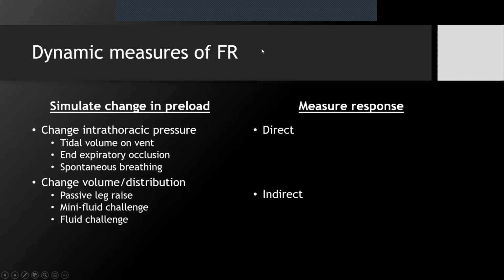So direct ways to measure cardiac output would be a PA line, but it's pretty time-consuming to wait for your Fick or to get a thermodilution. Pulse contour analysis, which is real-time continuous monitoring using some proprietary algorithms based on an A line, is used very frequently in the OR. We have a couple of them on Blake 8, not I think as available on Blake 7, also not frequently used so much on Blake 8, but it's one fancy new technology that's emerging.